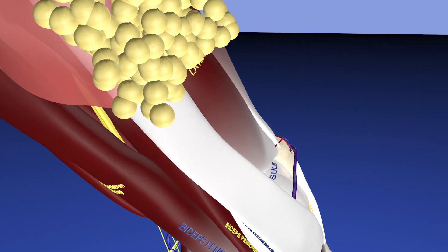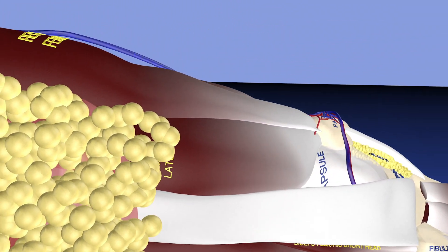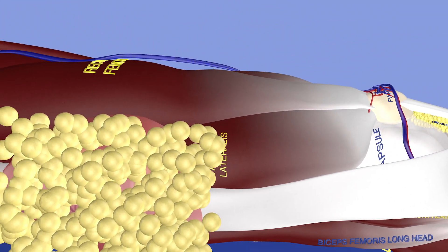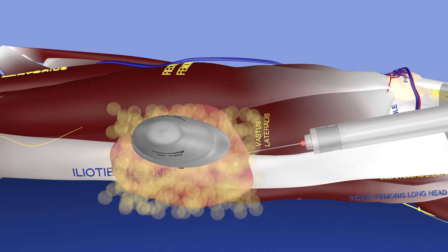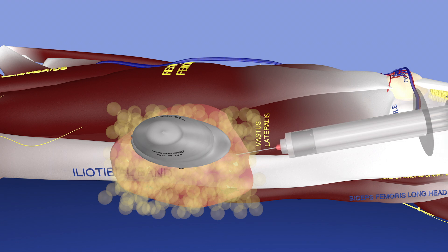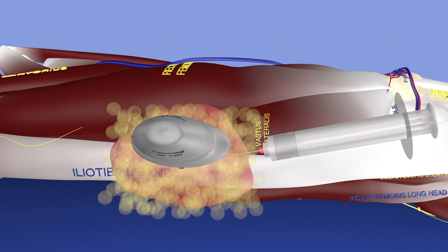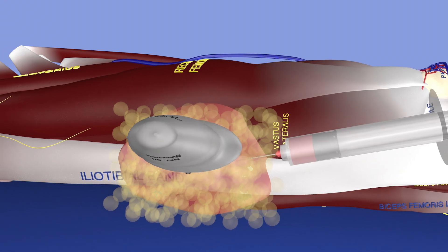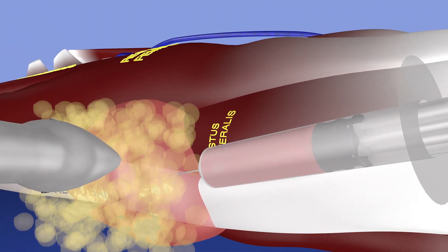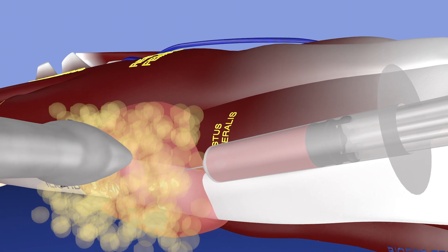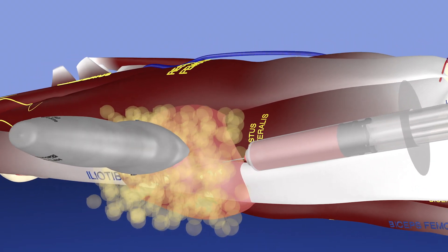Now we're bringing the thigh into procedure position as the patient lies supine. Here we are with our syringe — we made the subcutaneous fat somewhat translucent. The needle goes right into the inferior aspect of the lesion to allow gravity to help collect all the fluid. We aspirated through many syringes to get as much fluid out as possible.